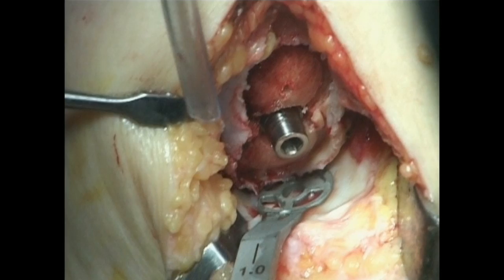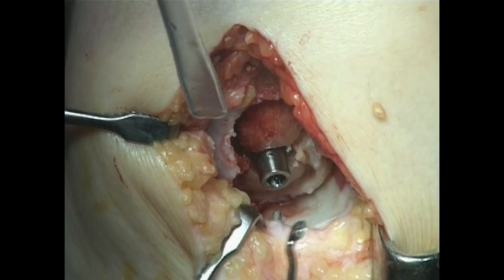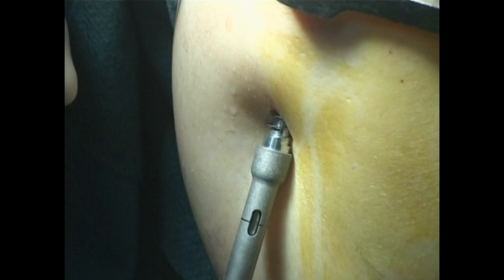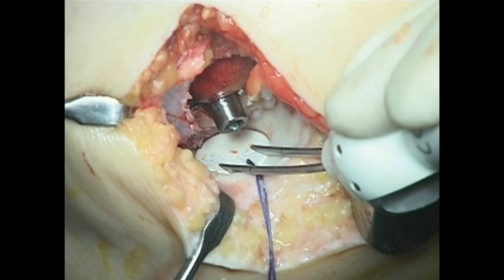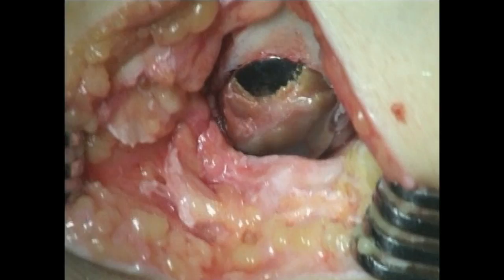The tibial template is placed centrally with respect to the damaged area of the tibial plateau surface. The drill-tipped pin is inserted through the central axis of the tibial drill guide until it reaches the centre of the tibial template. The tibial pilot drill is driven over the threaded pin until it reaches the centre of the template area. The threaded blade stop of the cutting blade is screwed into the bone. Finally, the cutting blade is connected to the blade drive shaft and the tibial socket is reamed. The sizing trial is inserted, anteroposterior and medial lateral positioning are confirmed, and the definitive components are implanted.